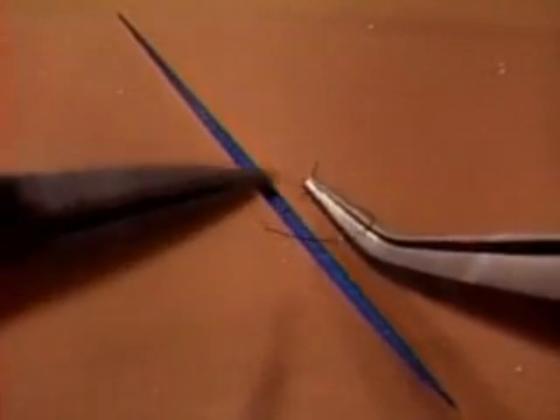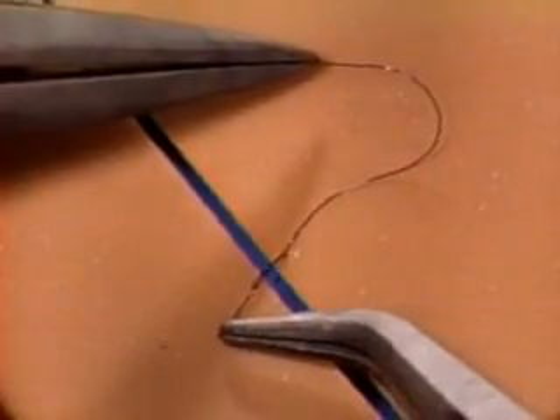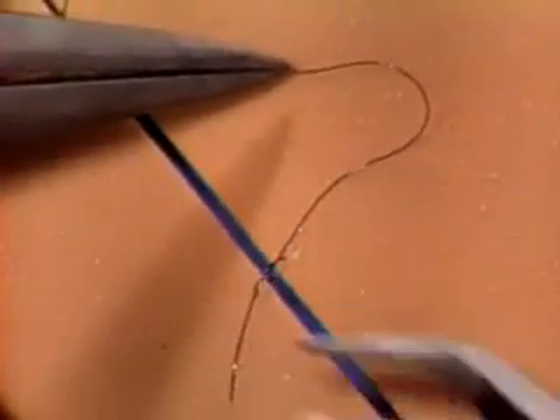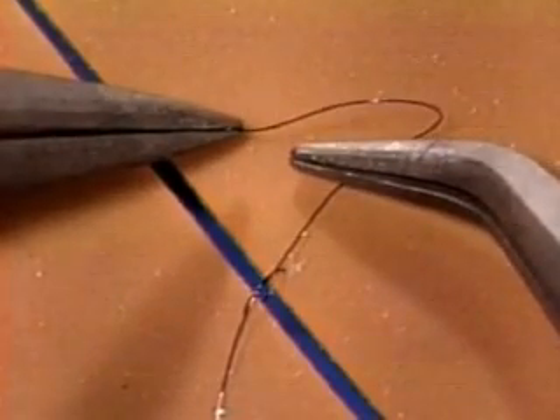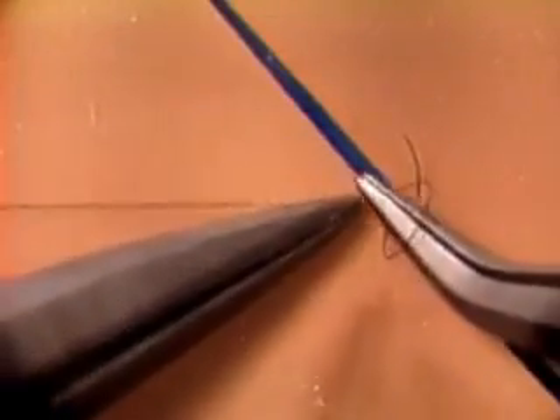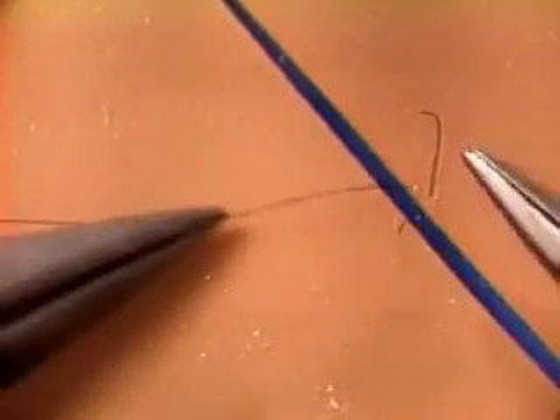Three things to notice here. First, you do cross your instrument tips as you complete the half knot — don't let that upset you. Second, you don't attempt with the first half knot to bring the wound edges together — that's a waste of time at this stage. Third, having completed the half knot, you definitely do not let go with your left hand, because from this position you lead straight into your second half knot. The sequence is: one, two, three, four — and when you've practiced it for a while it'll go just like this.